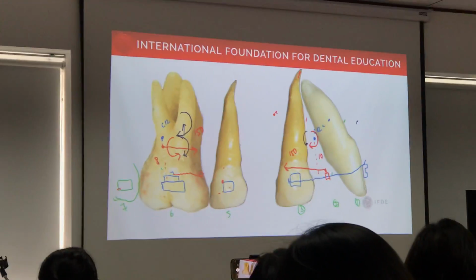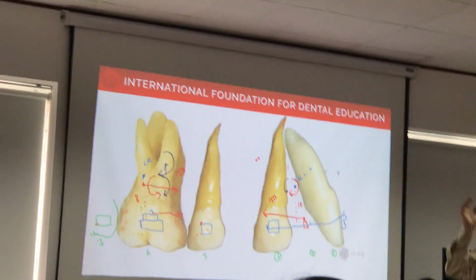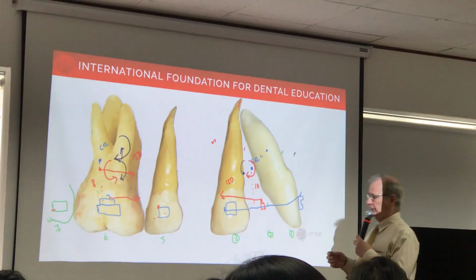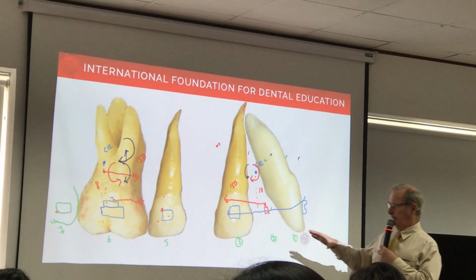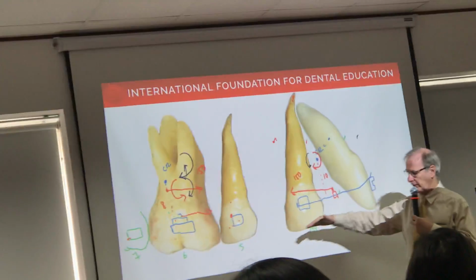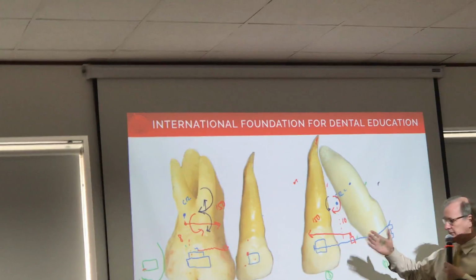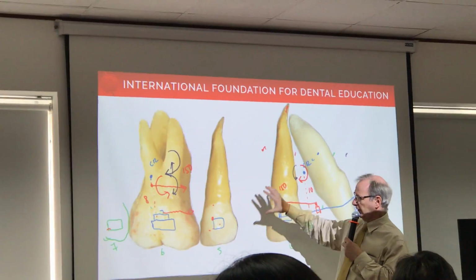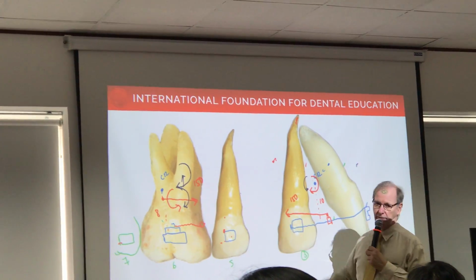So every time you put a wire in the patient's mouth, if it's a simple case, forget it. I'm talking more complicated. Thì nói là những cái trường hợp mà đơn giản thì chúng ta quay nó đi, bởi vì trường hợp đấy là quá đơn giản thì dùng cái dây thẳng được. Còn đây là chúng ta nói đến những trường hợp mà nặng. And you want to control, think of how can I slide, if you use sliding mechanics, how can I slide, how can I make this in balance, and how can I use the system to my advantage.